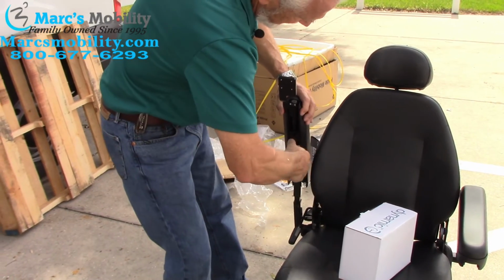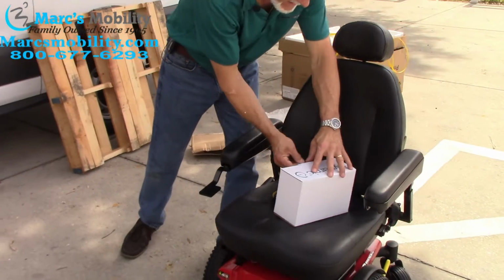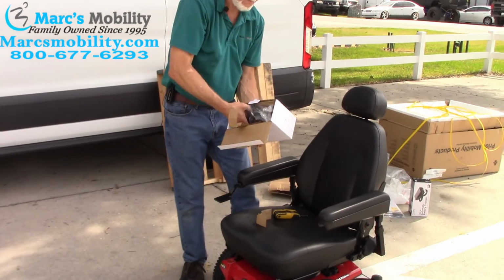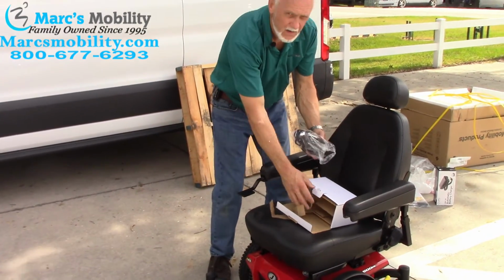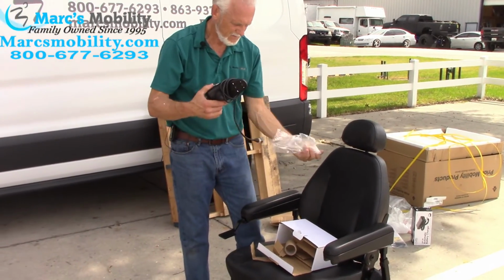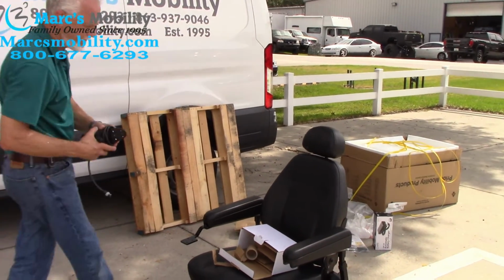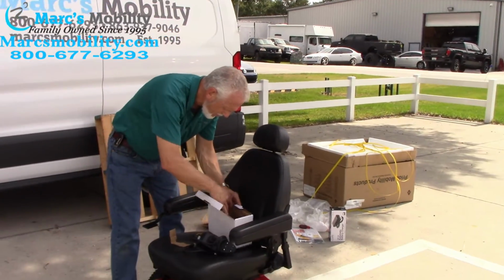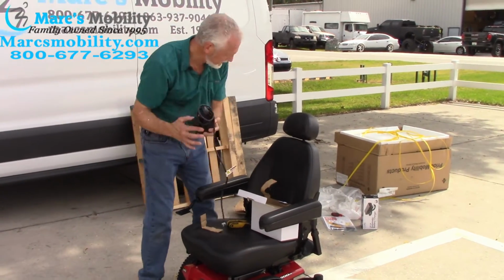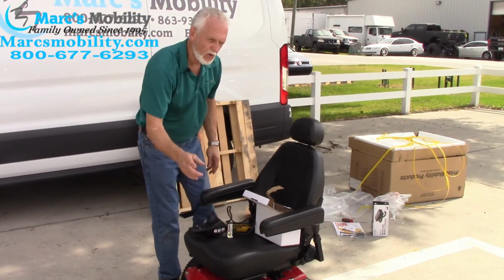Okay? Then you're going to take your joystick out of there. You're going to go back to your manual.